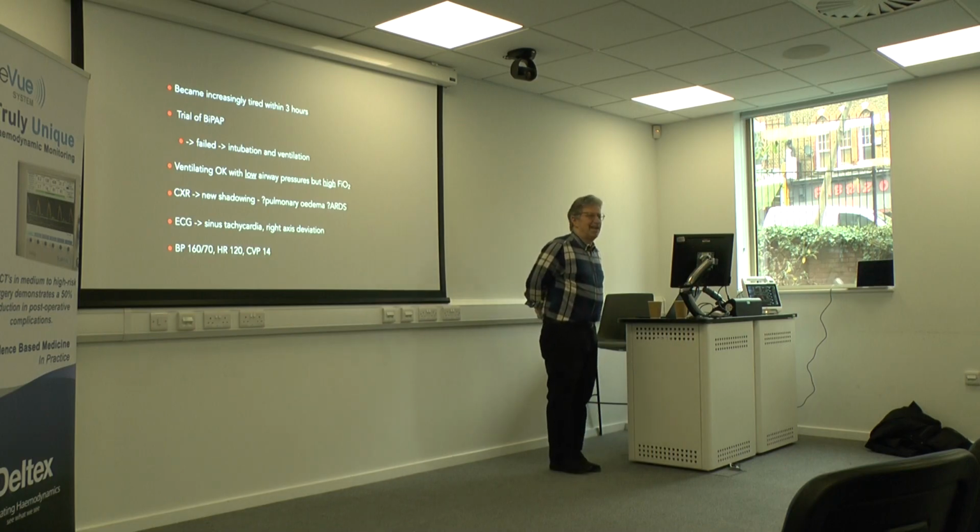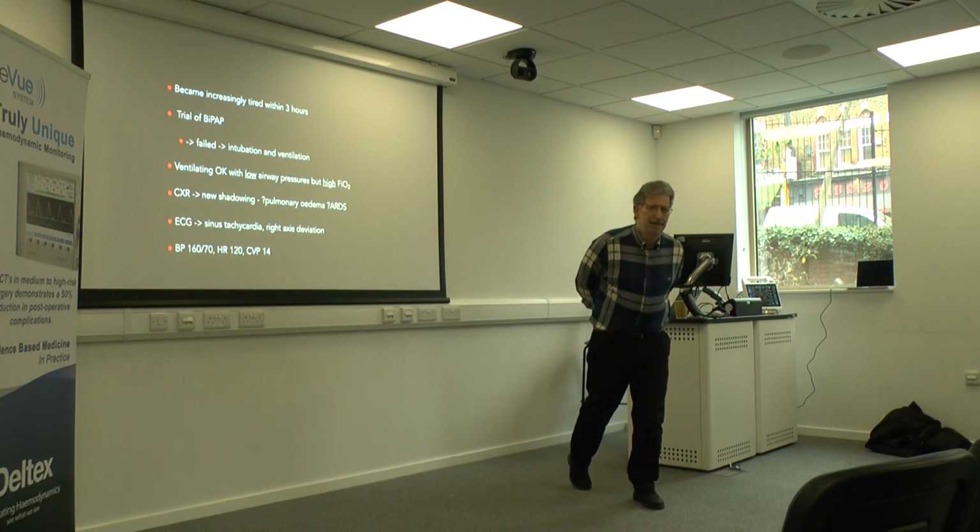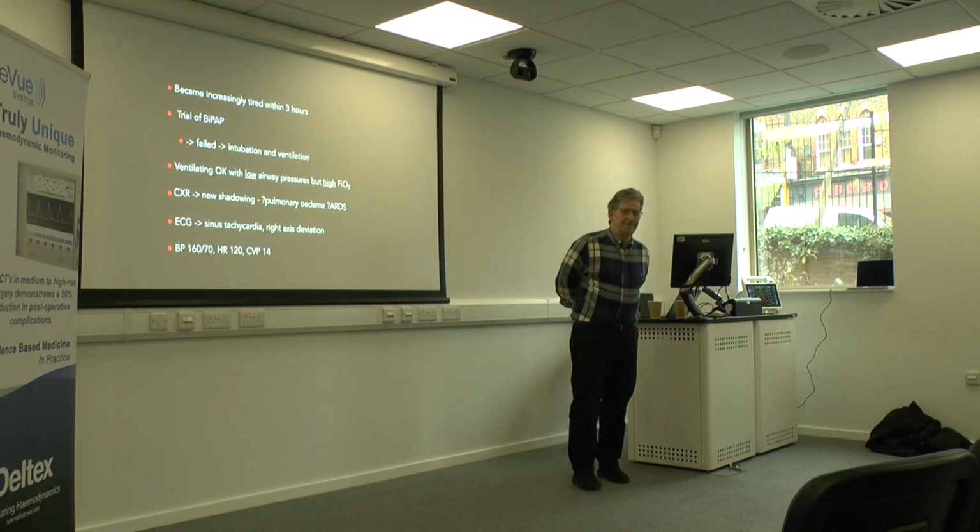Any offers? Well, this is a focus point. Okay. Just how good is POCUS?